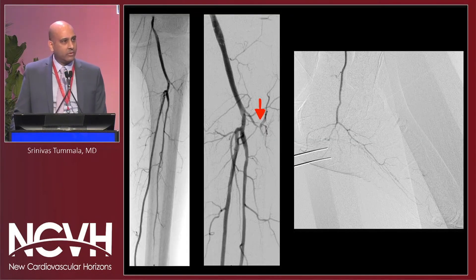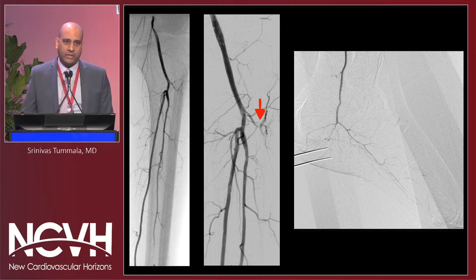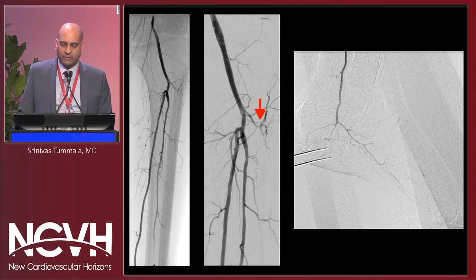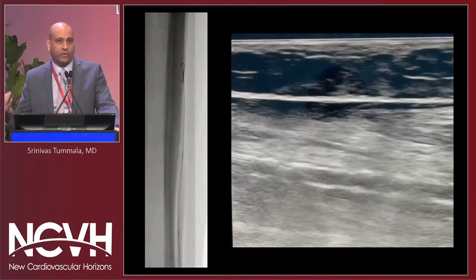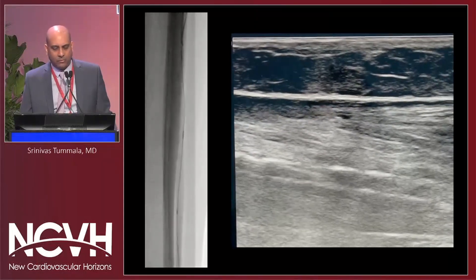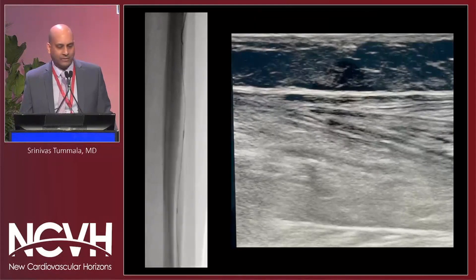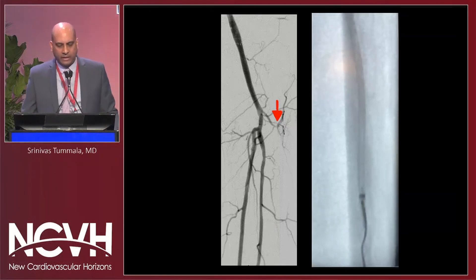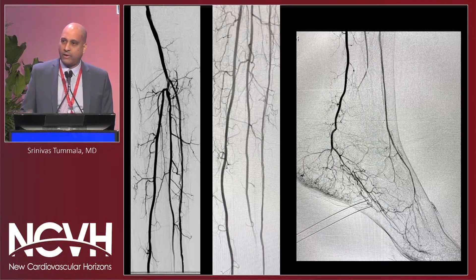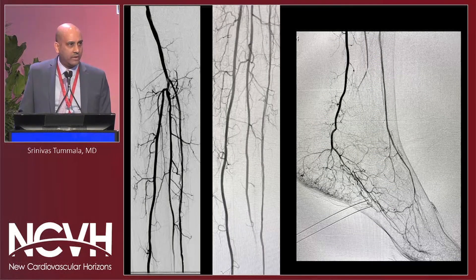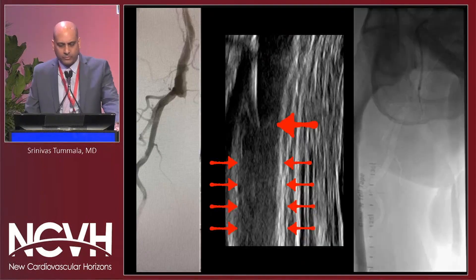Here's another CLI patient with an ambiguous proximal cap and an occluded tibular. It's a CLI patient with ischemia and tissue loss in the distribution of the anterior tibial artery. This is a tough recanalization from above because you're not really sure where that cap is. So I did retrograde access because we had a hibernating dorsalis pedis artery, which I was able to access with ultrasound. You can see the recanalization being done under ultrasound guidance, staying relatively intraluminal, then externalizing the wire, reversing access, and ultimately delivering therapy. This patient had a lot of hibernating vessels in the foot and luckily had an intact pedal plantar loop.